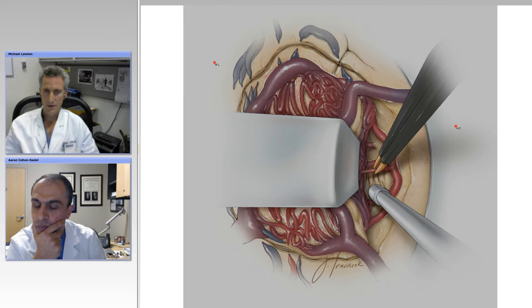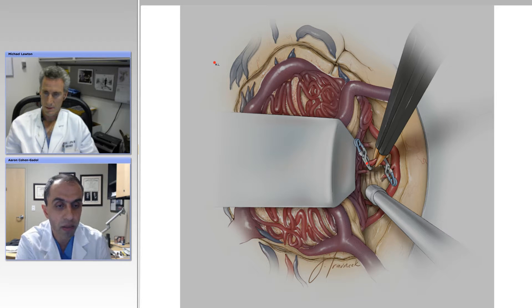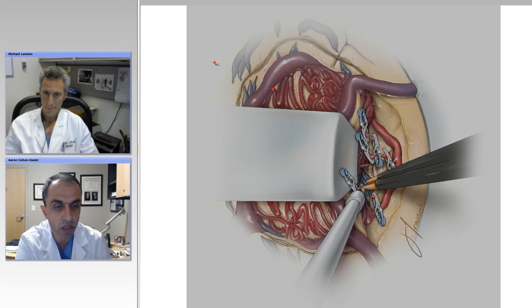As you're getting ready to tackle one of these feeders, you want to make sure you have a good length of the vessel exposed — not just a point of the artery — so that if things burst and start to bleed, you're not chasing it into the brain tissue. You want a segment exposed and ready to go to deal with any complication. As you get away from these white matter feeders toward more normal brain, they form a better wall responsive to bipolar coagulation, but then you're removing more normal brain. So it's best to have a good segment ready, then put clips — I use permanent aneurysm clips, the smallest you can find, as they're easier to handle rather than AVM clips. Put clips on both sides before coagulating.